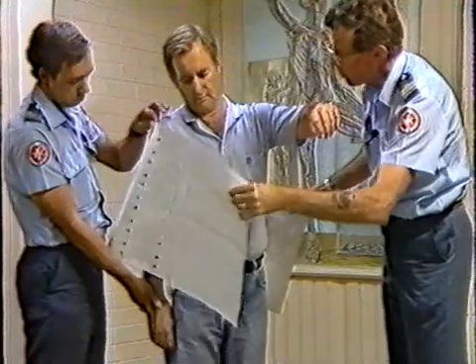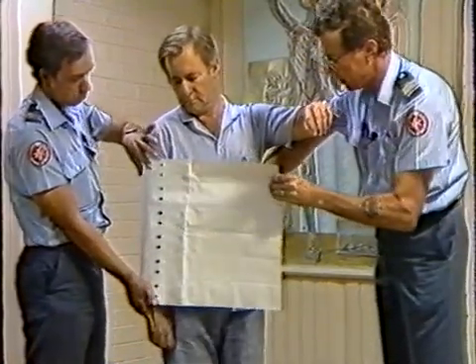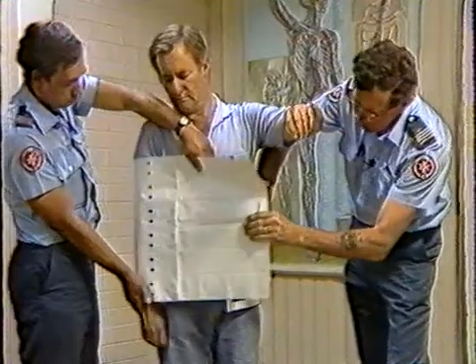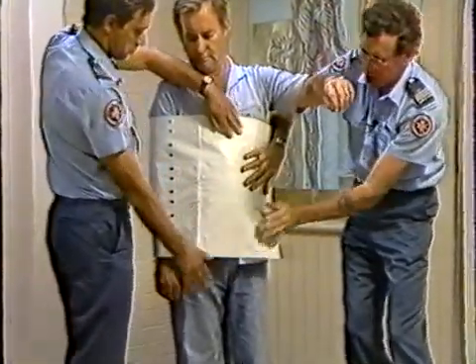And we get it just below the shoulder, leading edge in the front, and make sure it's equal across, and as firm as the patient will permit, we then strap it across.